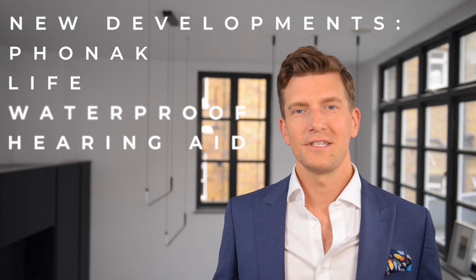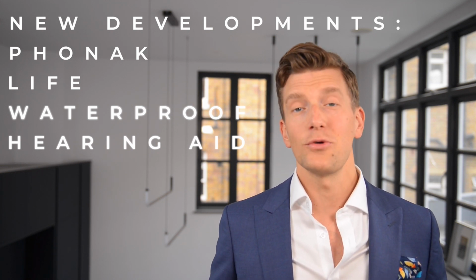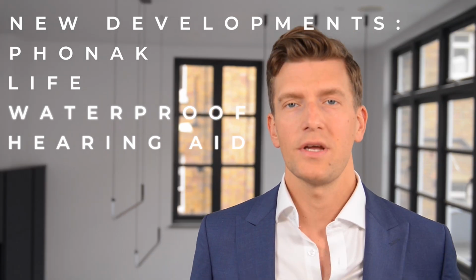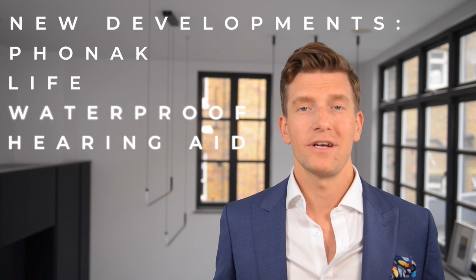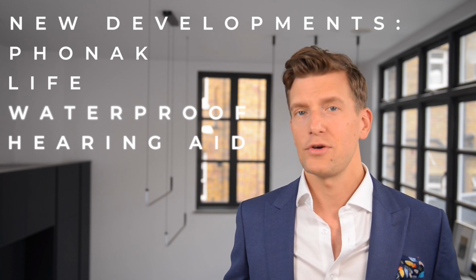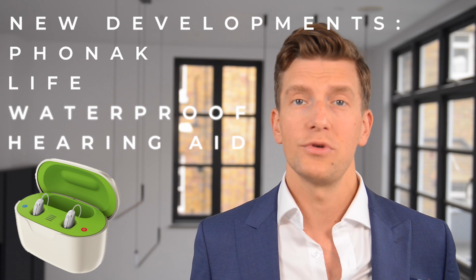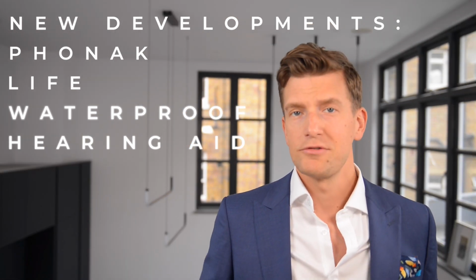hearing aid. To do this, they've had to add additional microphone protection, a parylene coating to all the components, they've had to put a silicone seal around all of the joints, and they've redesigned the way that the rechargeable hearing aids work. So currently the Paradise range have contacts on the bottom, and with the new Life range there'll be inductive charging, similar to that of Oticon, Widex and ReSound. This means that there'll also be a new rechargeable unit called the Charge and Go to go with these hearing aids.